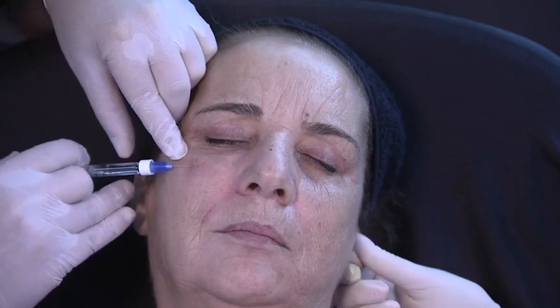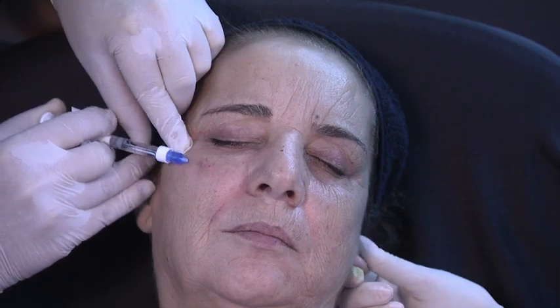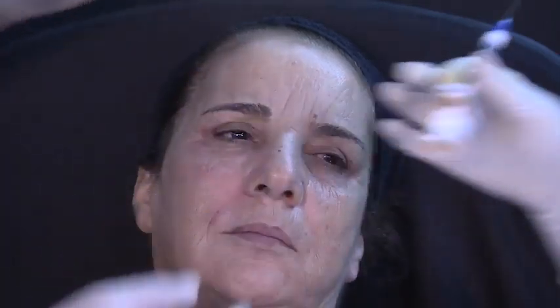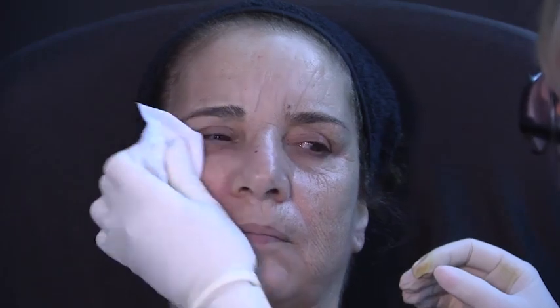This is a dangerous zone because we have facial arteries, so I need to be extremely superficial here. Okay? I don't want to do it with a needle in this area. I just want a 0.1 to avoid that sunken area. So that's why I'm using a cannula and Vital Light. It was a drop. I'm not even using 0.1. But like I said, avoid this hollow in this area.